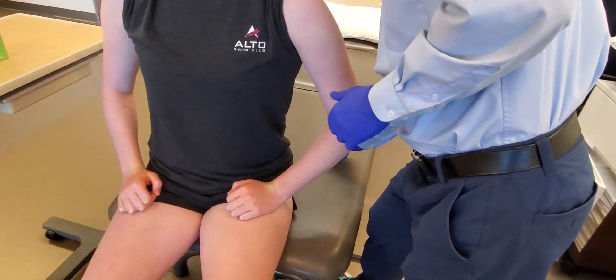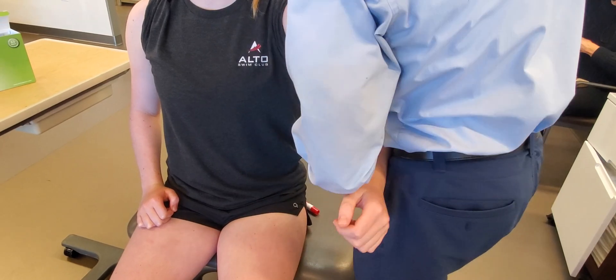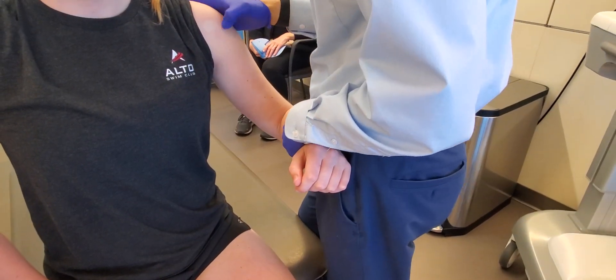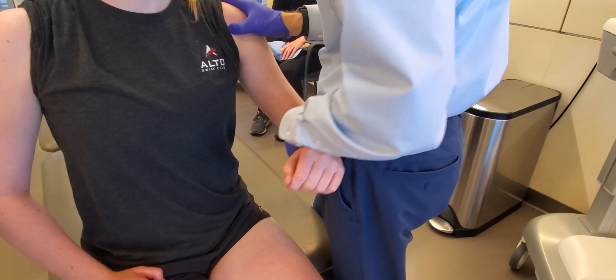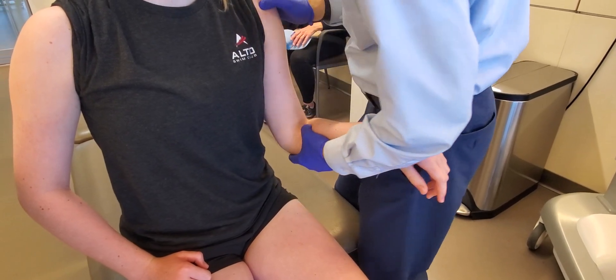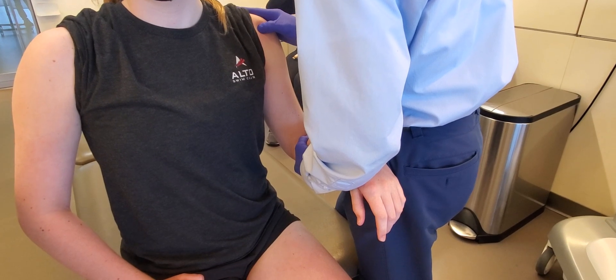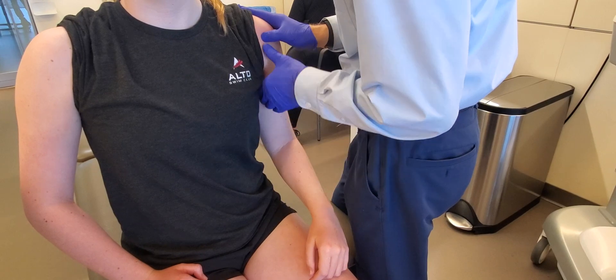We're going to find the bicipital groove. I'm going to bar your arm and palpate the front of the shoulder. Okay, the right one — go ahead and relax. I feel like we're pretty close, somewhere right in there. Is that accurate? Alright, go ahead and relax your arm.